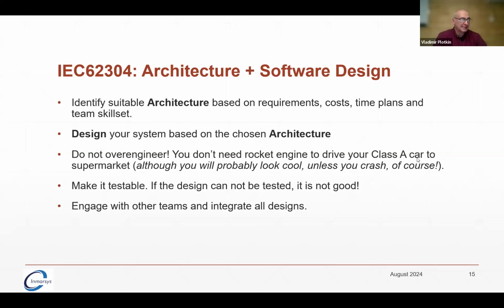The architecture must be testable. So if testers cannot verify the design, it's bad. So please ensure that your design is traced to the requirements and it really answers the requirements.